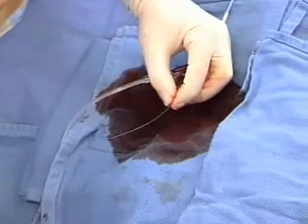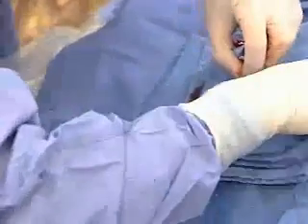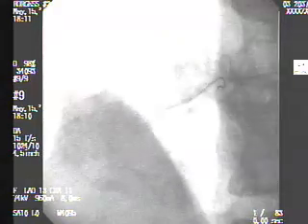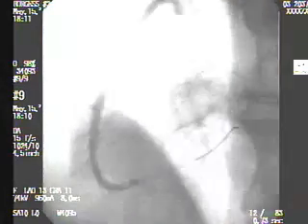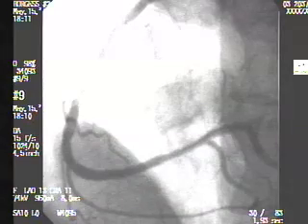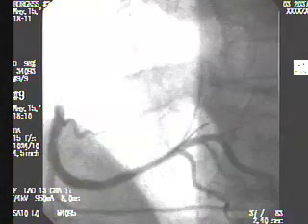Okay. Can we loop the angiogram? Just let that loop so the audience can see the angiogram a couple of times in real time. That last picture, please, just replay it, let it loop. I want the audience to get a sense of just how big we made that area that was blocked by putting that stent in. And that side branch that was just past the blockage is still there. We always worry a little bit about pushing some of the plaque into that little branch, but in this case, we didn't. We see a very good result at both ends of the stent.